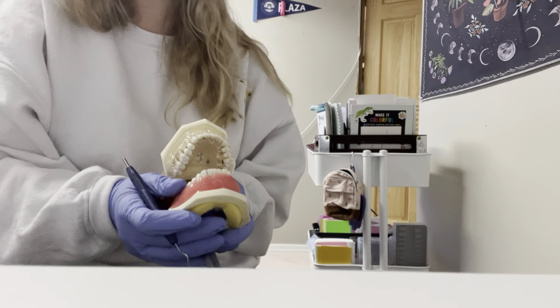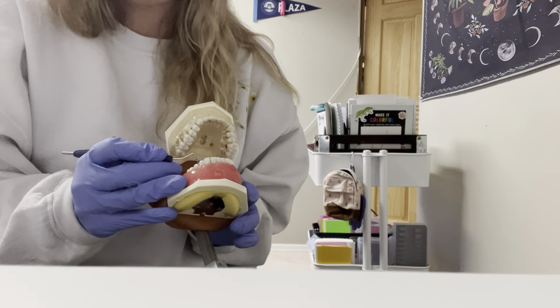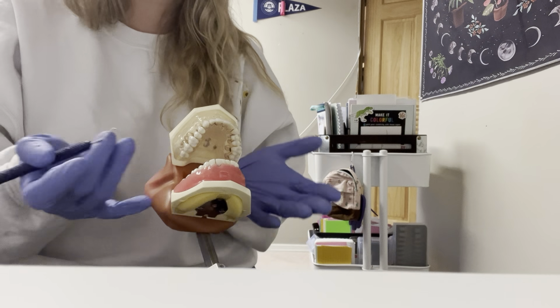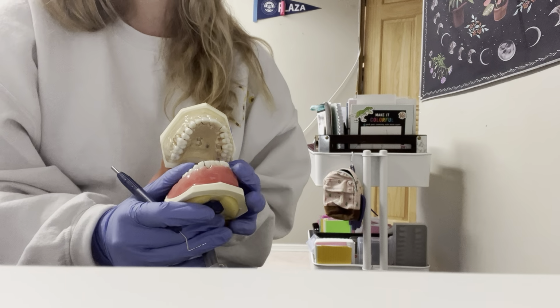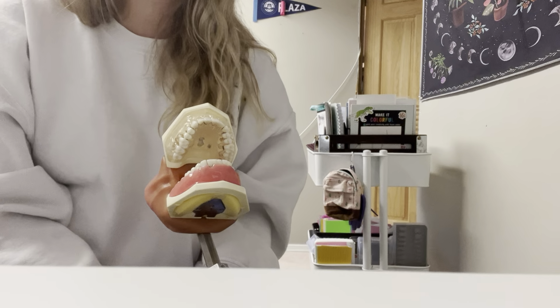There are a few reasons why we probe. We want to get the perio reading so we can get the pocket depth. You also want to get furcation involvement, CAL, recession. When we probe, we're going to probe on every single patient that we have in our chair. And along with that, we're going to do a bleeding index on the patient, plaque scores.